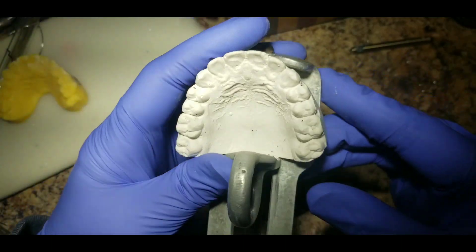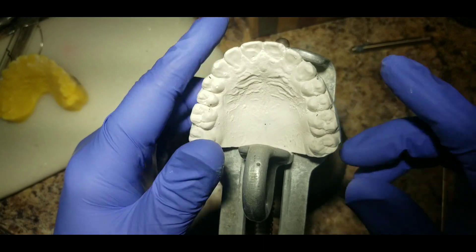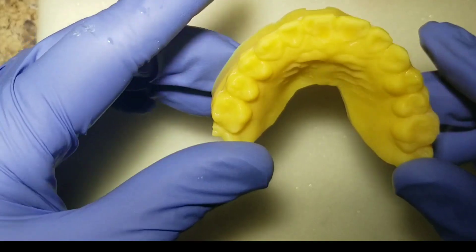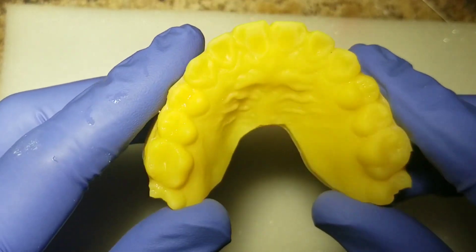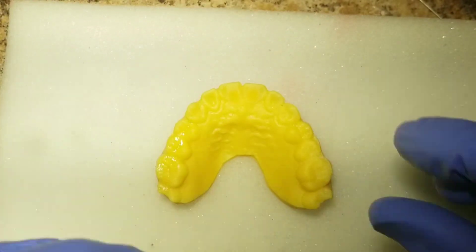What most of you are probably used to is taking a plaster model — a large plaster model — throwing it on your model holder and being able to bend wires. Without having a model holder and being controlled by that, you can go right from the processed model to bending the wire to finishing your retainer and moving on.